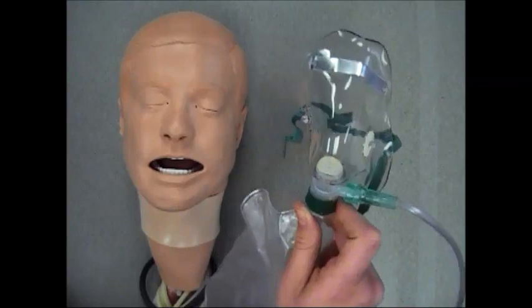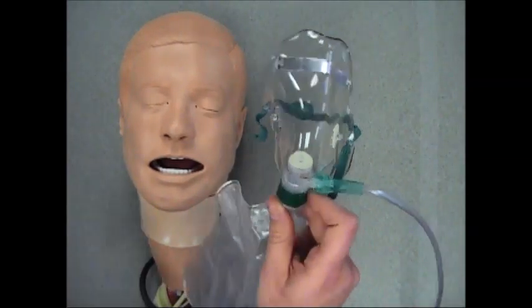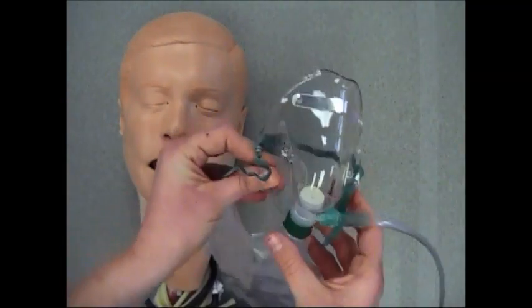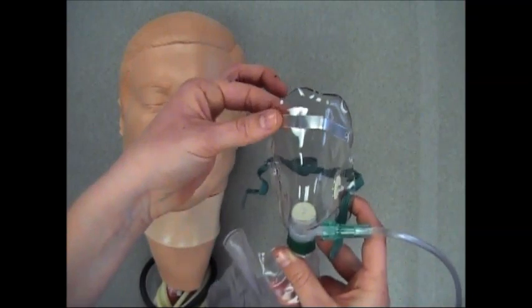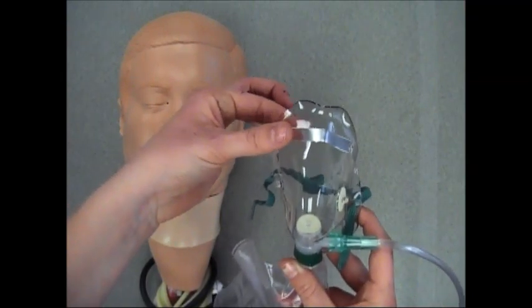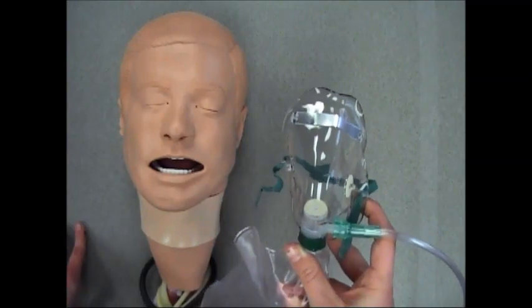It should be set to at least 10 to 15 liters of oxygen per minute. As you will see here, the mask will fit over the patient's nose and mouth. It's got that metal piece at the top that will be conformed to the patient's bridge of the nose to allow it to be secured to the patient's face.